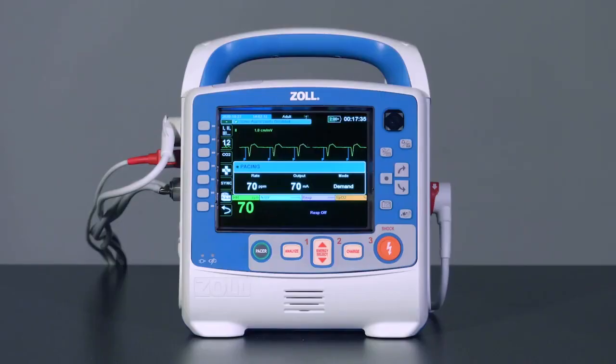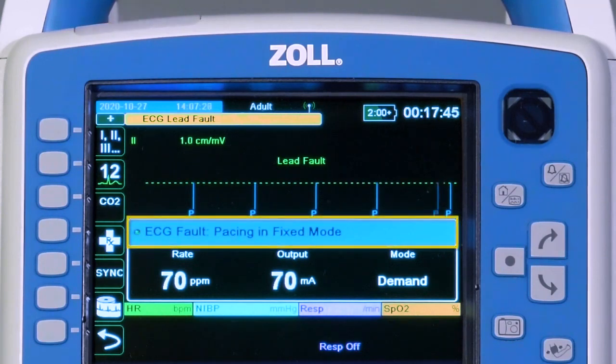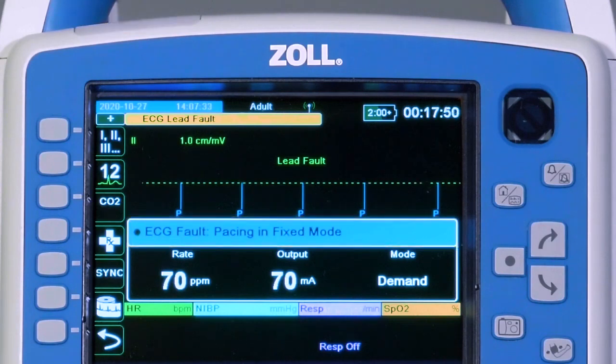If a limb lead is removed during demand pacing, a device alarm will sound and the yellow LED will illuminate. In the pacing dashboard, the message ECG Fault, Pacing in Fixed Mode will be displayed. The alarm can be paused for 15 seconds by selecting Alarm Pause.